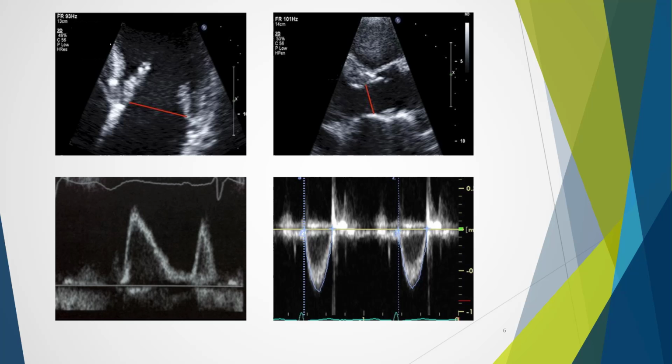This is an example of how a sonographer will proceed to acquire the necessary detail for the calculation. We have the mitral annulus dimension taken from the apical four-chamber view. A zoomed image is preferable to enhance 2D imaging and increase accuracy. Leaflet insertion point to leaflet insertion point is taken on a frame in early diastole when the valve is widely patent. This gives us the diameter, which we use to determine the cross-sectional area, as we can clearly see here.